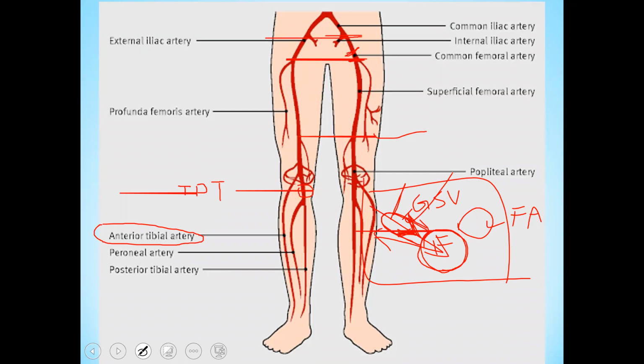You should check the compressibility at this level. While compressing at this region, you will get an image like this. This will be the same femoral artery, but now the common femoral vein and the great saphenous vein will collapse and disappear. So in cases of normal femoral vein and great saphenous vein, they will disappear with compression. You will get only the femoral artery. Right?